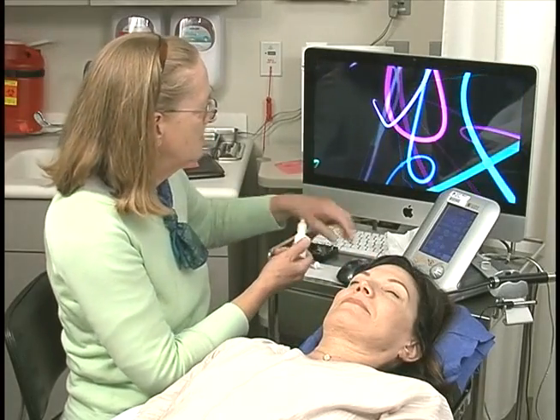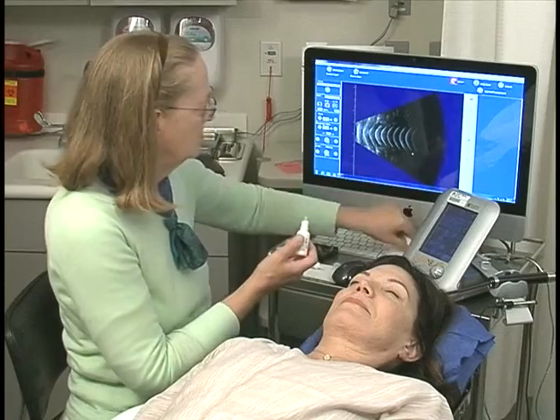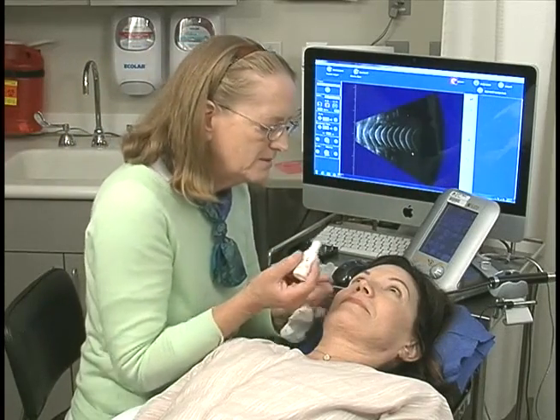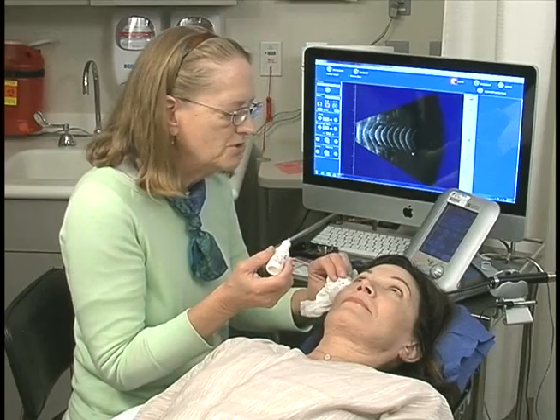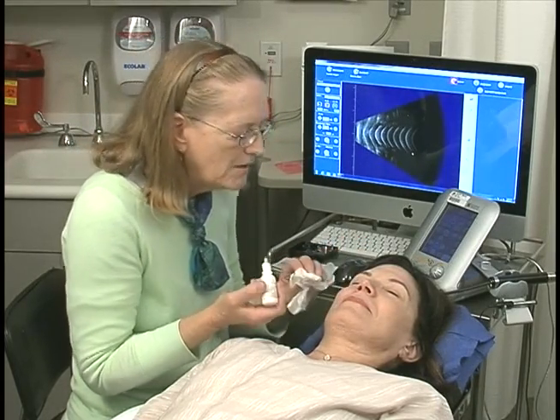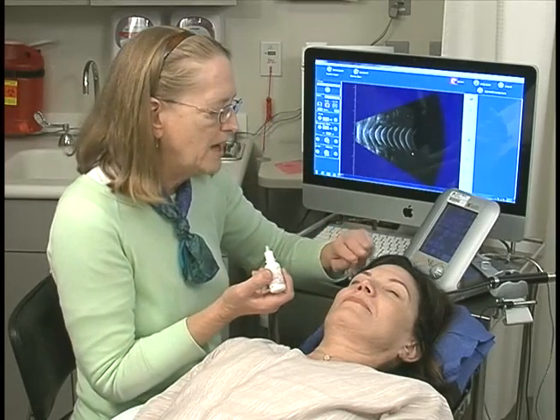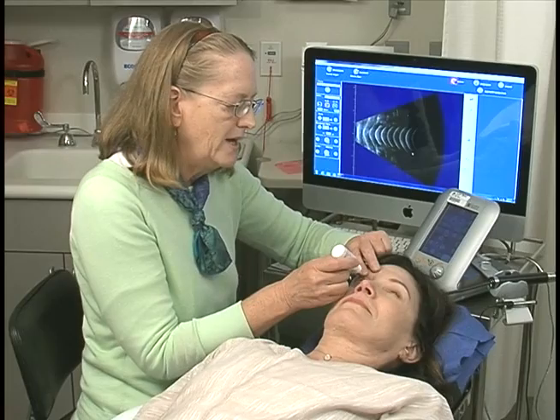We'll begin by instilling a drop of anesthesia. Would you look up, please? A drop, and close your eye. Blot gently — do not rub your eyes. You have a tissue to blot, but don't rub. Look down — I'll put a second drop. Look way down to your toes.